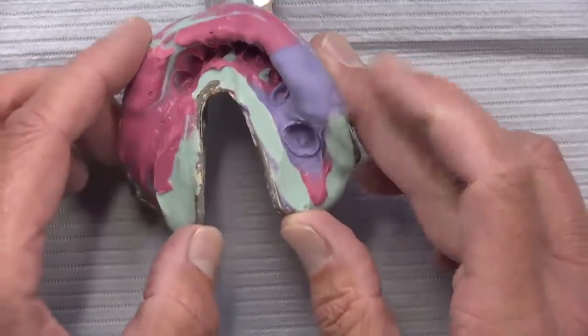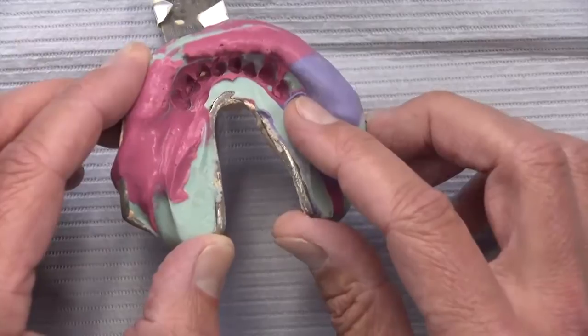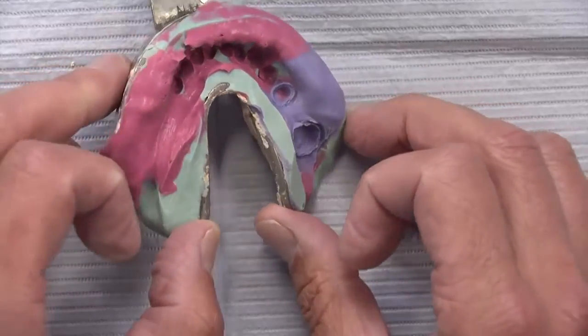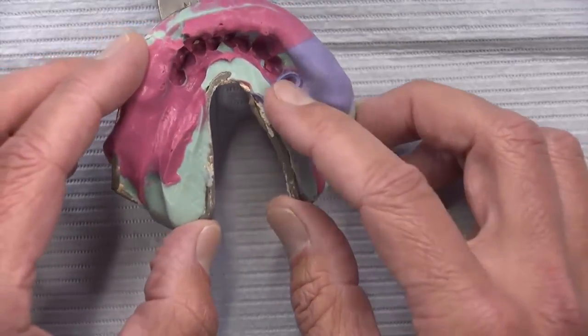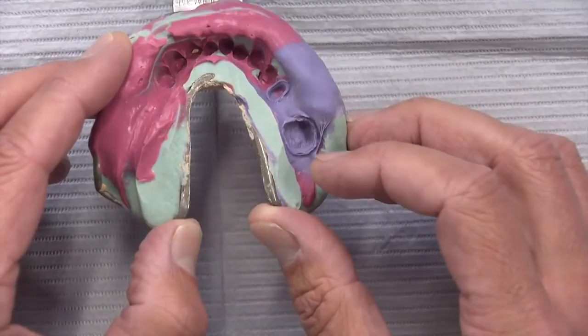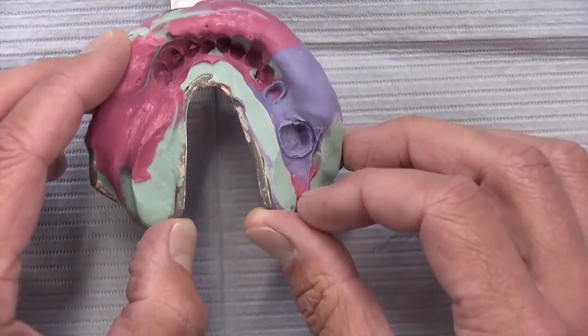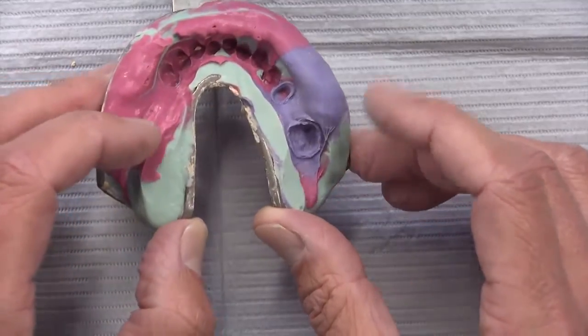But when you go in and you just see this purple material now is here on the prep and here on the prep, and then the rest of the teeth are just covered in the red, there's got to be a difference in the level, in the vertical height between these 2 teeth and the rest of these that are in the red. And that's one of the issues that we have with the H&H technique is that some of the teeth are being represented by one impression material.